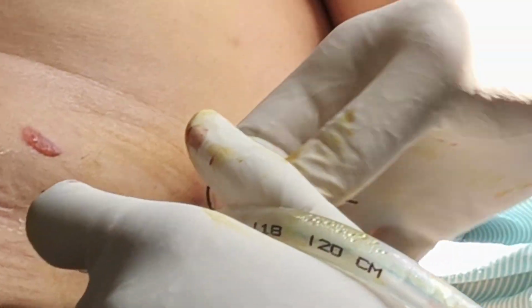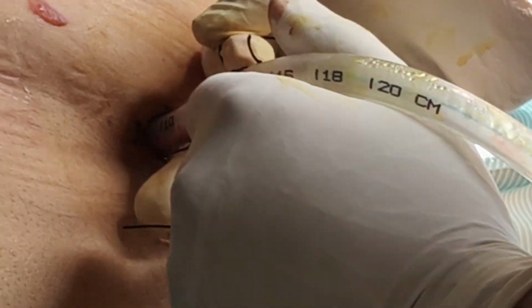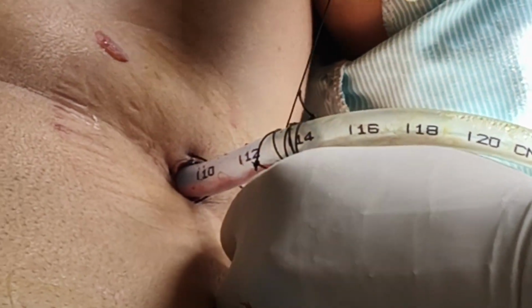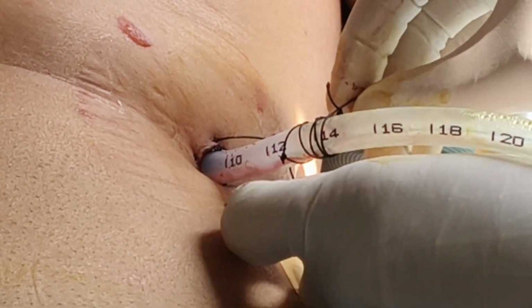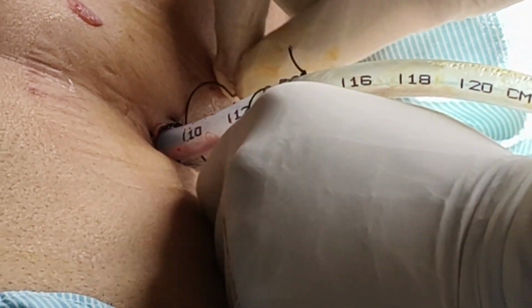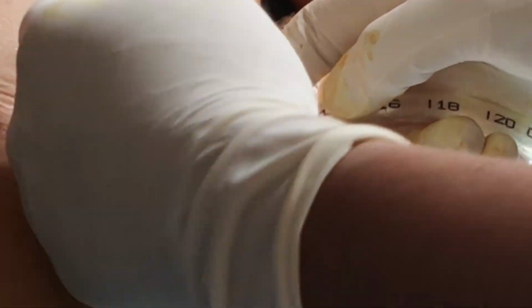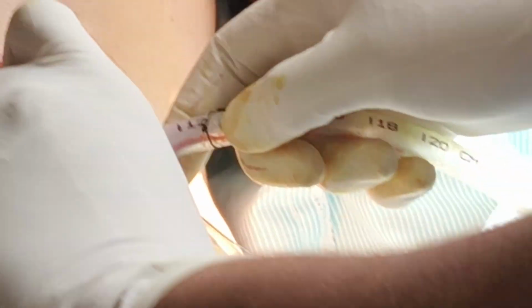But before that, you have to take a single knot, a single throw first, so that you only have to tie the second knot. Okay, I forgot that, I'm sorry.